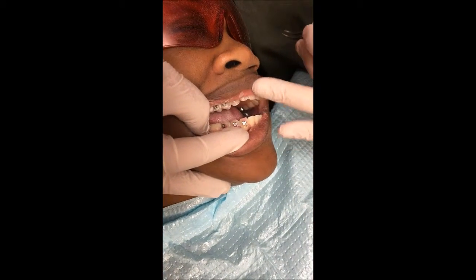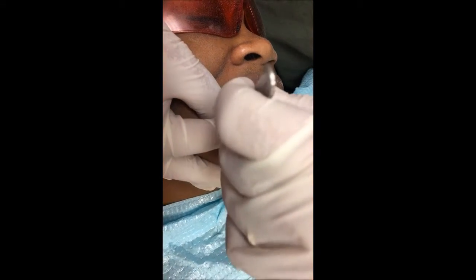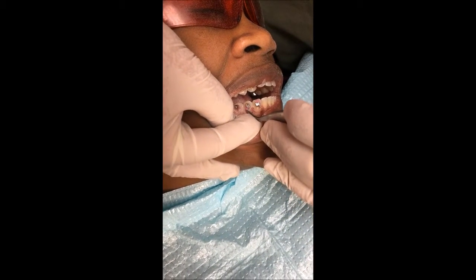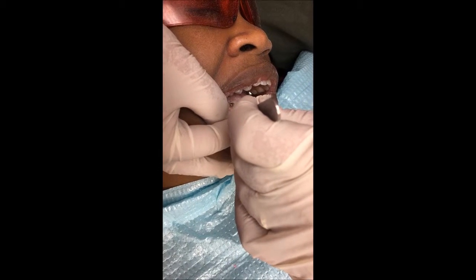Sandra, would you please bite down and let's see — good, you have perfect clearance. Open again. Now I'm just taking off the excess glue, then I'm going to put a little bit of glue.